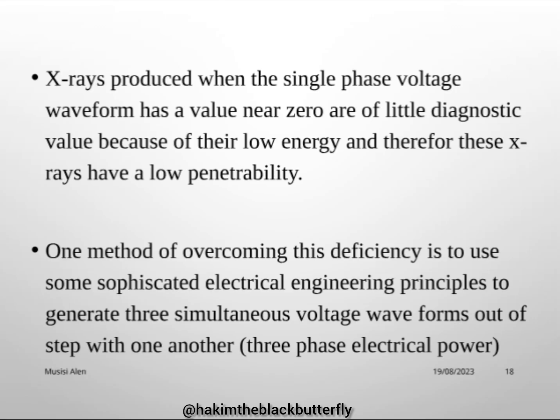X-rays are produced when the single phase voltage waveform has a value near zero. That is when the voltage is going back to zero. The X-rays produced at those moments when the voltage is falling to zero are of little diagnostic value because of their low energy, and therefore these X-rays have a low penetrability.